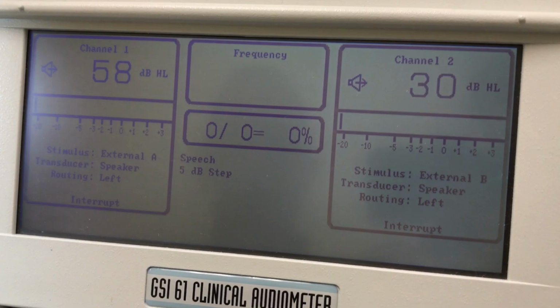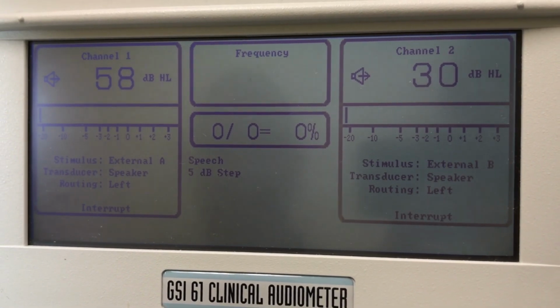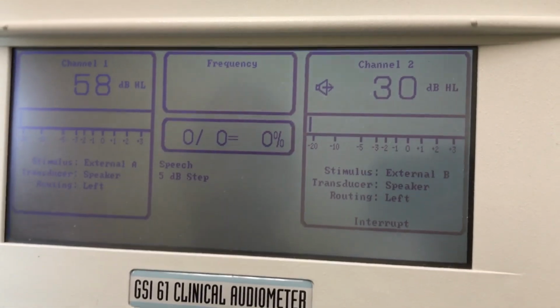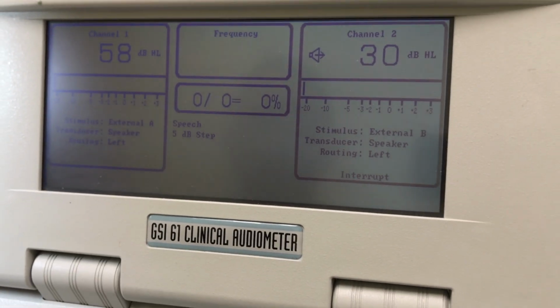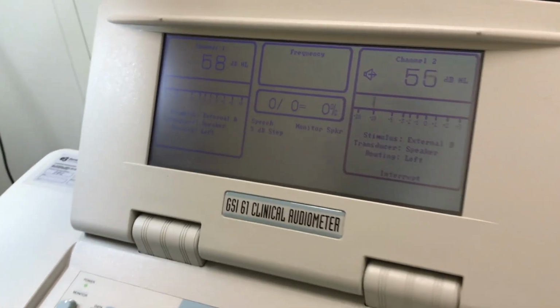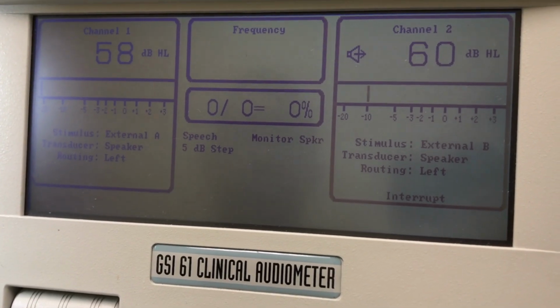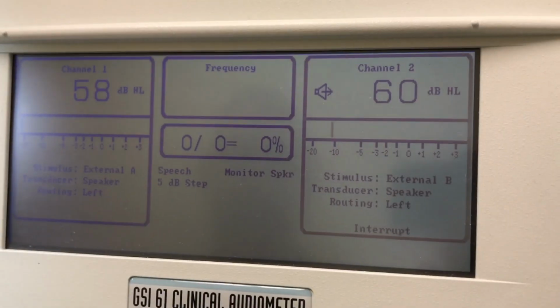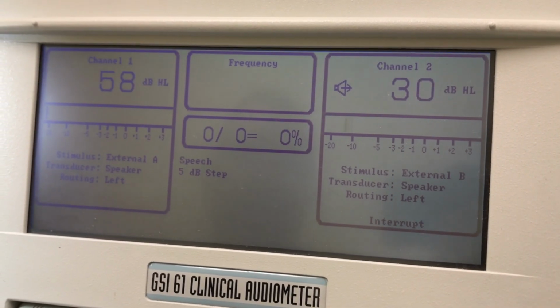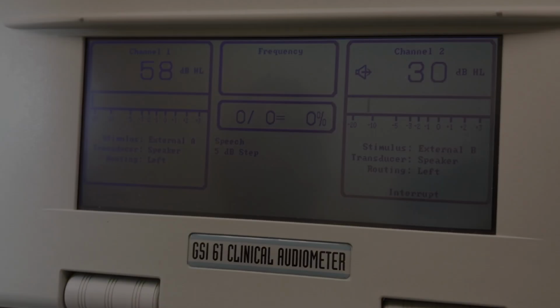Okay, so for measuring the background noise level, or the BNL, I want to demonstrate what that background noise sounds like. I'm going to turn channel 1 interrupt off for our purposes here, and we're going to focus just on what is coming out of channel 2. So we'll hit play on channel 2. And as you can tell, the signal is one that is multiple people speaking at the same time. So basic multi-talker babble will be the background noise that we'll use for this test.